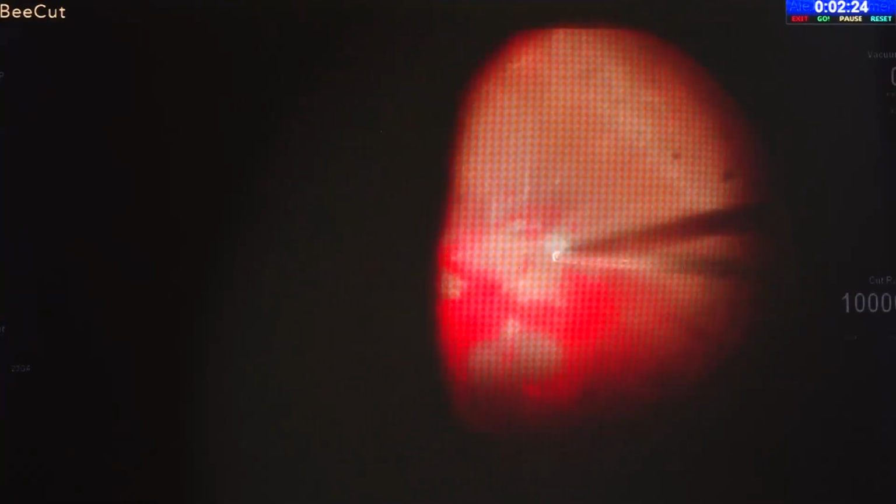So this is the cutter which I am using for combined retinal detachment. I generally use a 23 gauge system. Sangeet has shown with a 27 gauge system. You can see even with a combined retinal detachment, the retina is quite stable and it does not jump as much as you would expect. However, you still have to be very cautious because the retina is thin, mobile, and you can end up with multiple iatrogenic breaks. So you need to be very, very cautious.